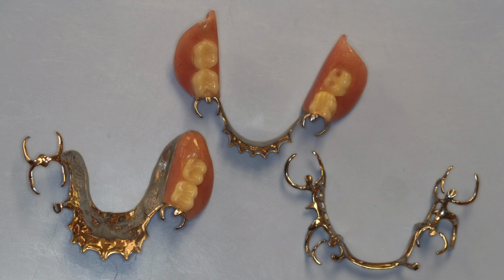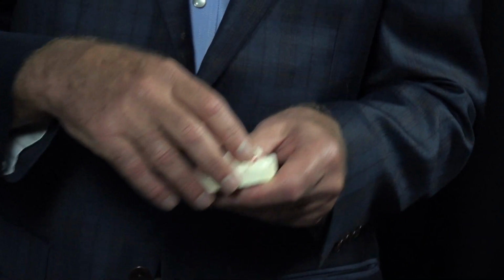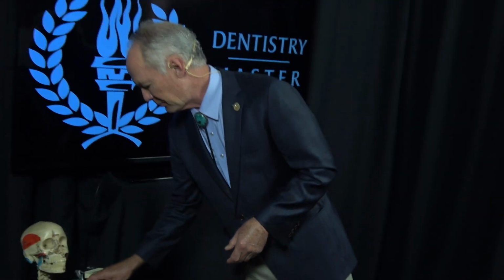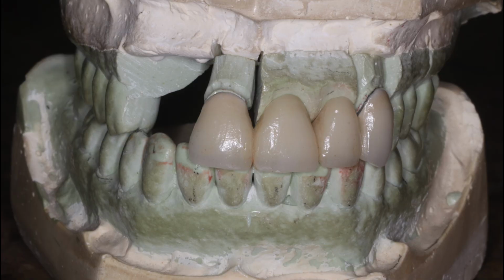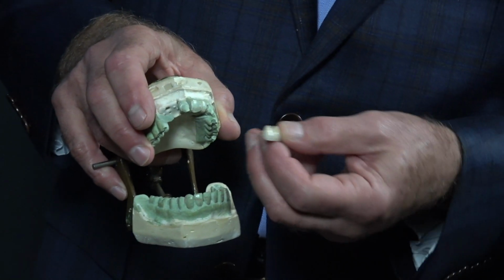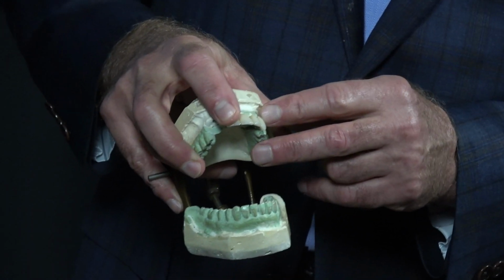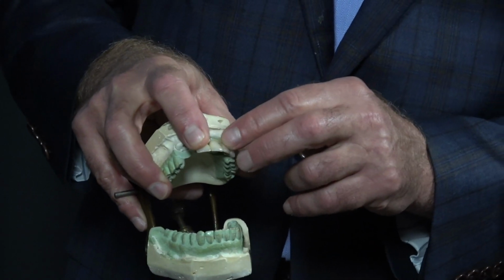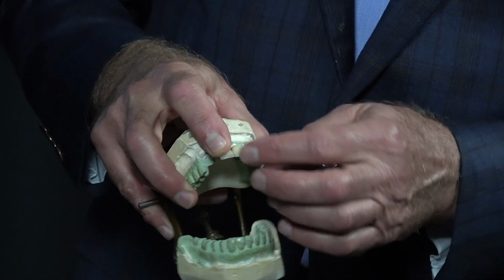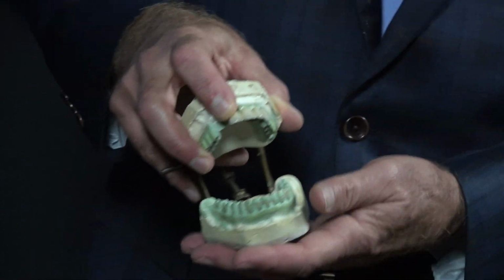This would be a removable partial denture that fits into the edentulous spaces and it attaches to the remaining teeth. This would be a fixed bridge which attaches to the tooth on each side of the edentulous area. The reason they call it a bridge is because the teeth on each side would be the land and the missing teeth would be like the water. So it connects from the land across the water to the land.